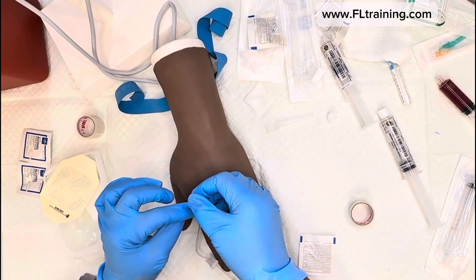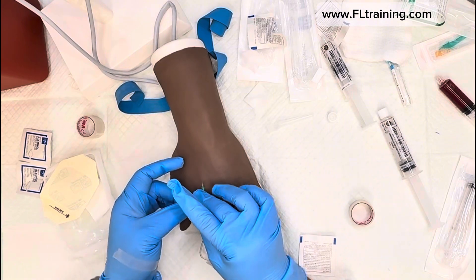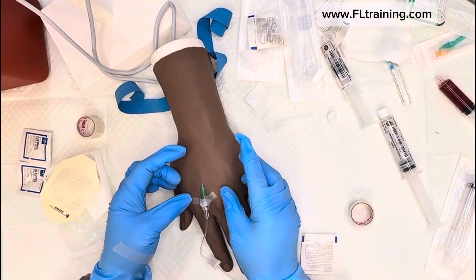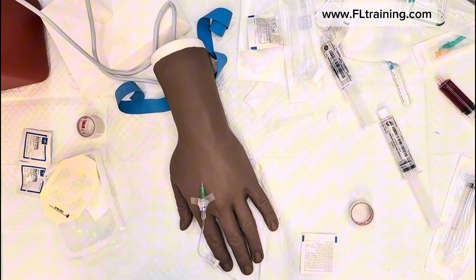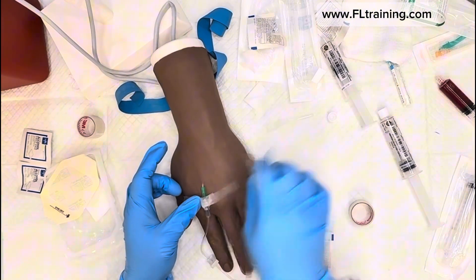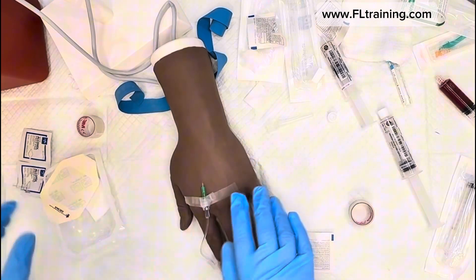I'm going to go under with a small amount of tape, putting it on the hub — not taping the actual catheter. Be careful with pulling, as it can cause pain to your patient. This is a mannequin so the tape isn't sticking as well as I'd like, but just pretend it did.